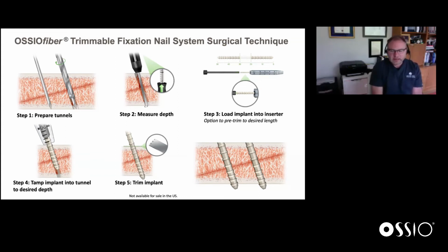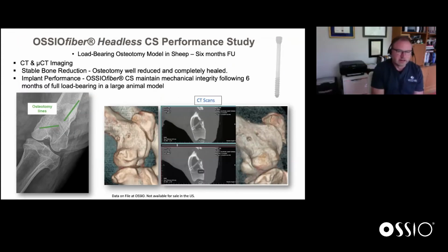Full disclosure for me, as I was getting to look at both of these options, I was going into the cadaver labs thinking, well, I have no interest in these nails. I just want a screw. I know how to use a screw. Screw's going to be way stronger. And I've flipped 180 degrees. I think these nails are incredibly robust. They're actually very simple to put in because you're just manually tapping them in without having to use a screw or screwdriver. And so I've actually been converted to probably be a nailer, not a screwer. Sorry.